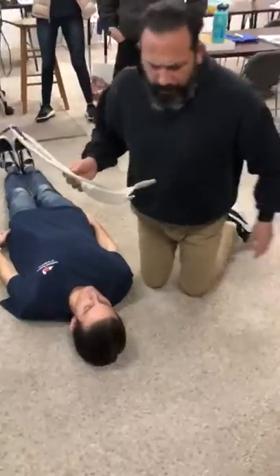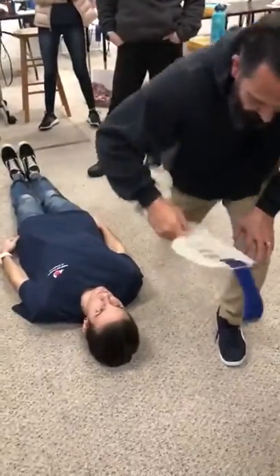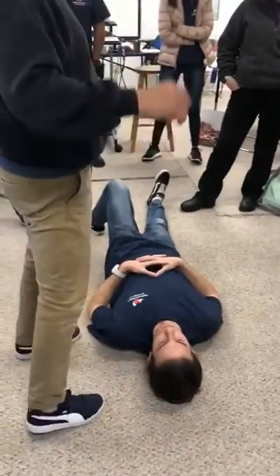We're going to put the collar on the patient. Partner, come back down. I've finished the head portion. Now we're going to measure and put the collar on. He's holding cervical spine precautions for me.